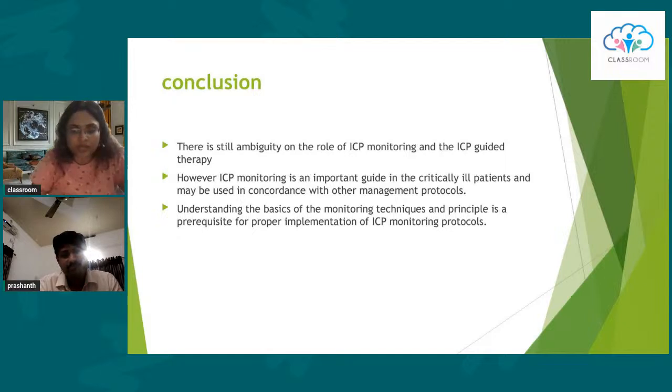Yeah, so many times the patient can still have a raised ICP despite DC, maybe because it was not properly done. Only a small portion of the bone was removed. So yes, we can definitely monitor even after the decompressive craniectomy.